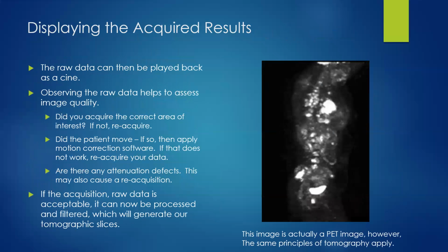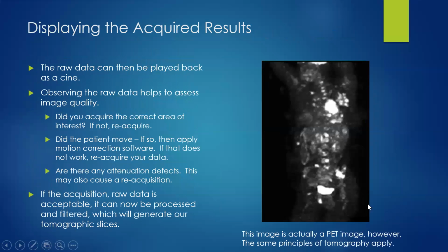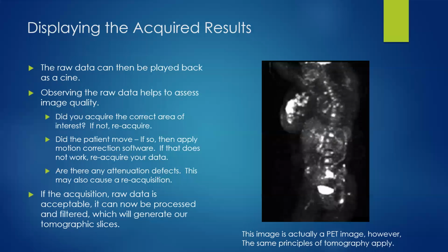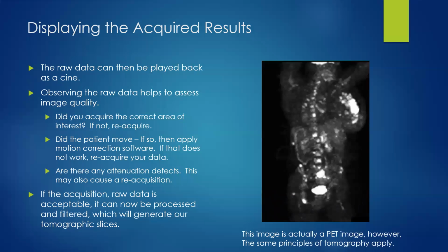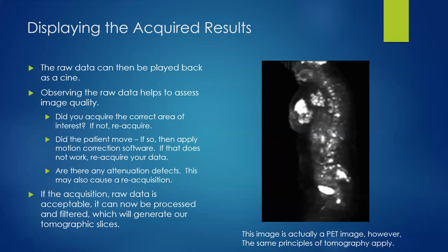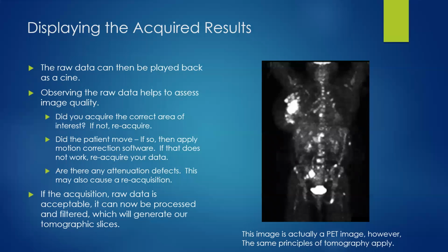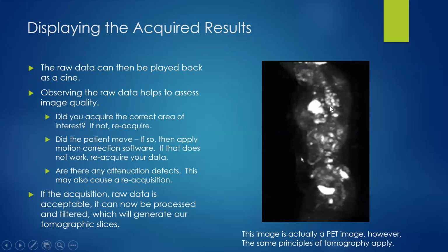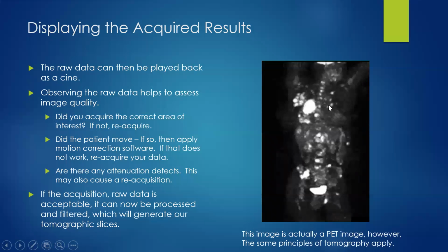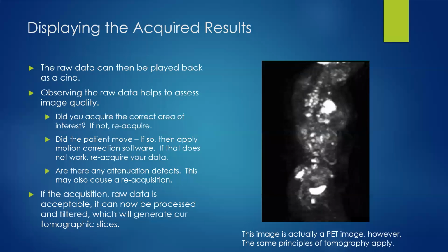So here's an example of what we just saw on the prior slide, and that is we have a patient here that's spinning around in an axis. I should also point out to you, this is really not a SPECT scan, but it is a PET scan. Now, that being noted, it's still the same basic principle, okay? It's still the same back projection that's going on that we're actually assessing here. And what we're looking at here then is the raw data as the patient spins around. And if you're curious, this unfortunate person or female has a breast tumor located right here that we're actually assessing. So, you know, we look at the raw data. What are we trying to do here?